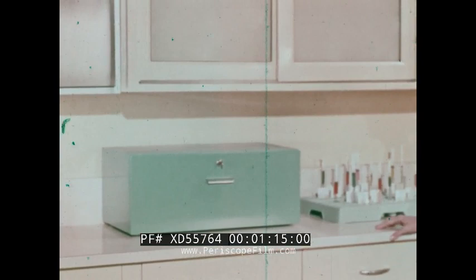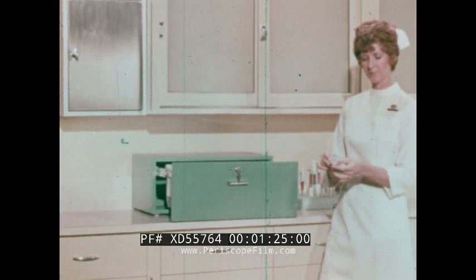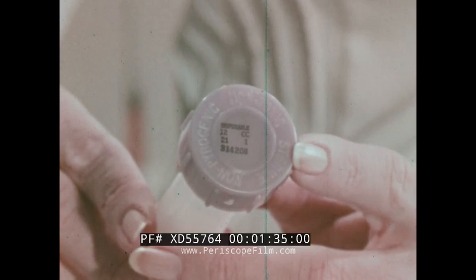Syringes and needles are conveniently stored in the Monoject syringe locking case. Color coding by needle gauge of the cap and the sheath of the unit makes quick identification possible. If desired, the cap, which is imprinted with the syringe size, needle gauge and length, and sterile lot control number, may be used for inventory control.